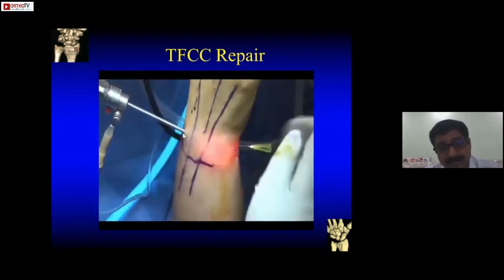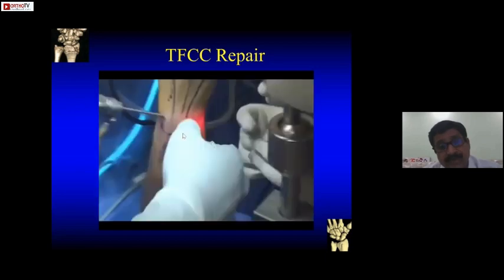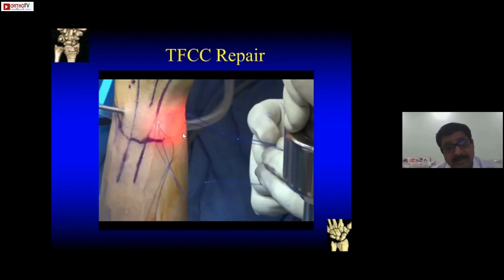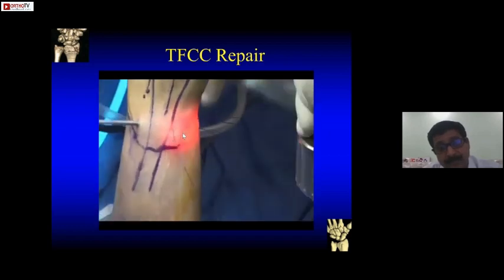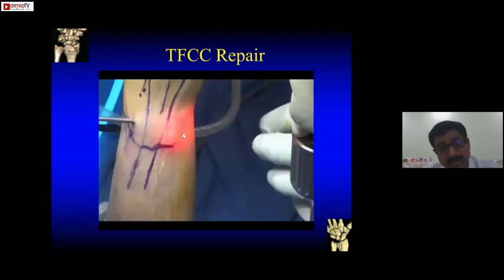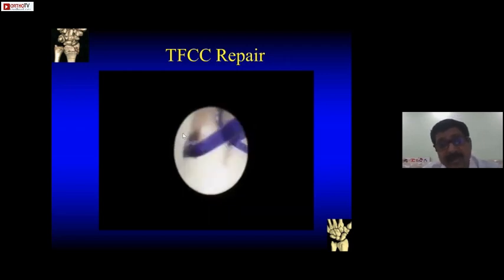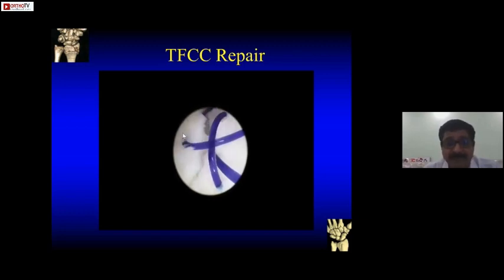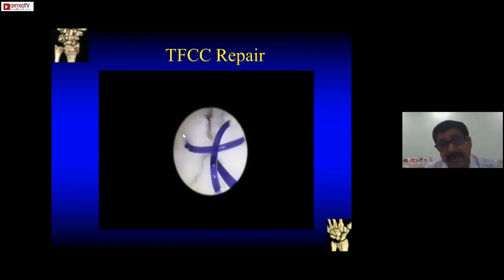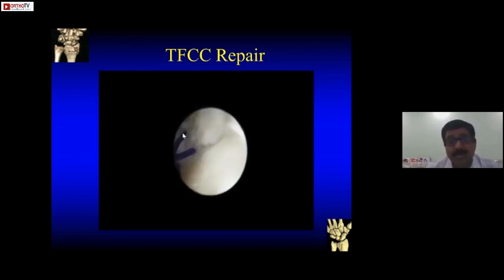Seeing the same procedure from outside: pass the loop, retrieve the loop outside, then pass the earlier suture through the loop. Once you pull the loop, you retrieve that suture through the capsule to the outside, so both ends are out — that's one suture made. According to the tear, you can make multiple sutures. This was a complex tear in which we made three sutures. Once you tie them, all the edges should approximate — this is how the final picture should look like after arthroscopic repair.